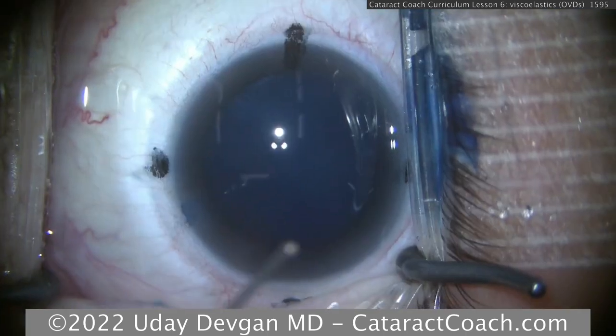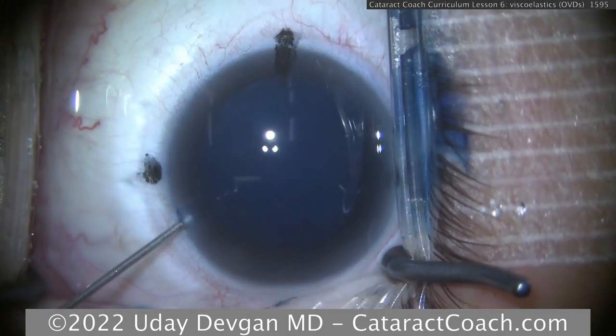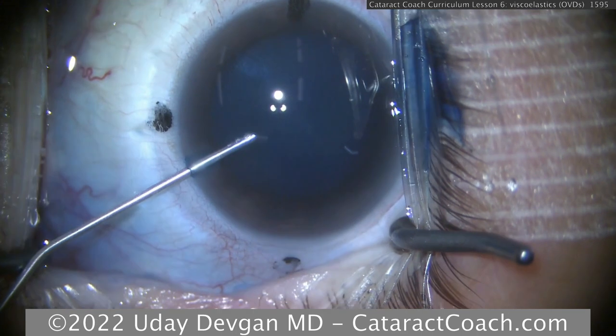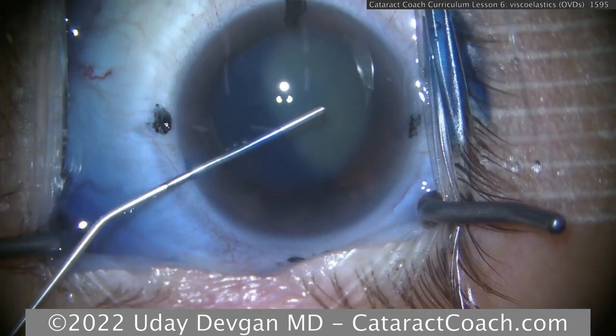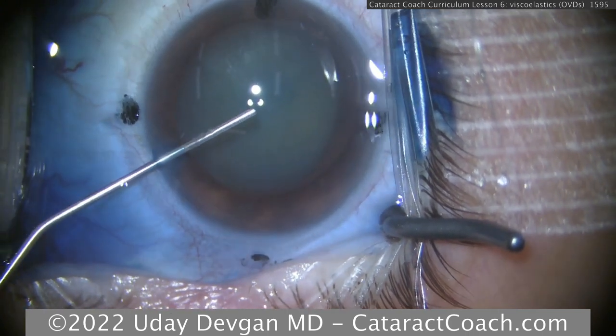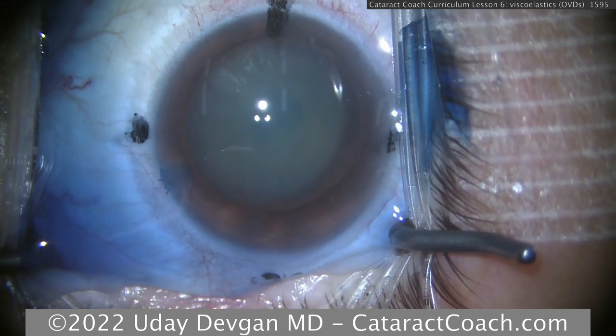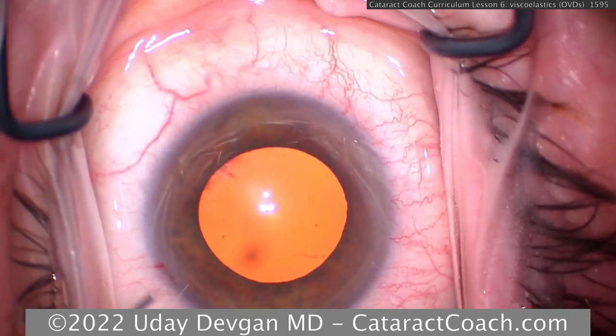So you push the plunger a little bit harder, more force, and then you'll get a nice wave of dispersive viscoelastic. So coming across the eye here, watch how the blue dye is displaced, just like that. A nice clean wave, and that's the reason we come across the anterior chamber to the opposite angle of the eye. So let's watch this a few more times.